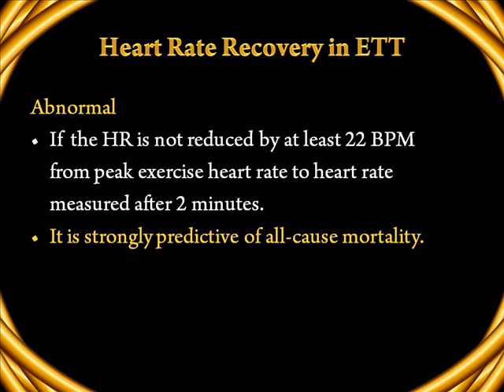What is heart rate recovery in exercise testing? During peak exercise, we would have seen the maximum heart rate. From then, during the recovery phase, the heart rate comes back to the baseline heart rate. This is what is called heart rate recovery. How much is good enough? That is the question. During the first 2 minutes, there must be a drop of at least 22 beats from the peak heart rate that is achieved.